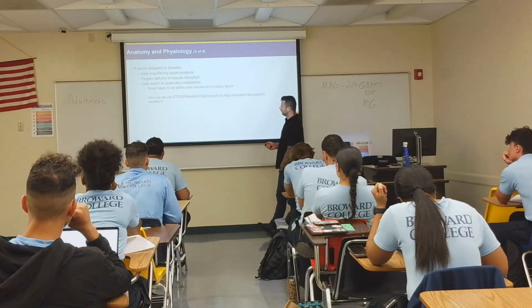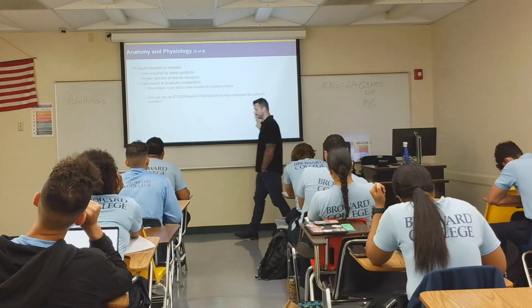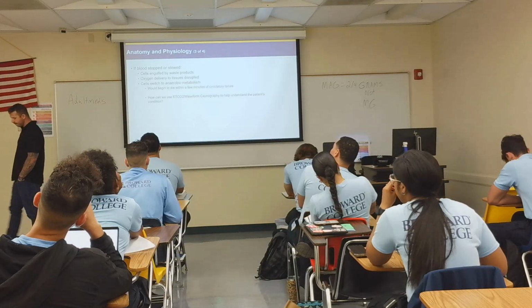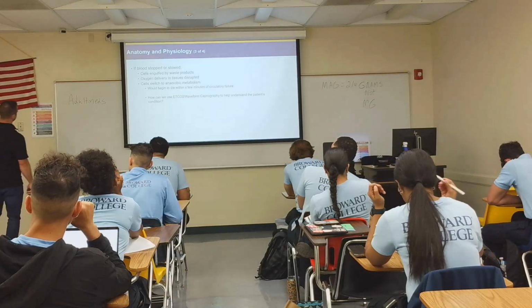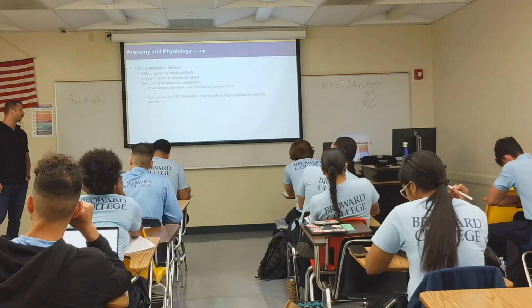So, how can we use end-tidal in our waveform to help understand the patient's condition? What does end-tidal tell me? If your patient is offloading CO2 properly, right, my off gas. So, we're gonna have different waveforms.